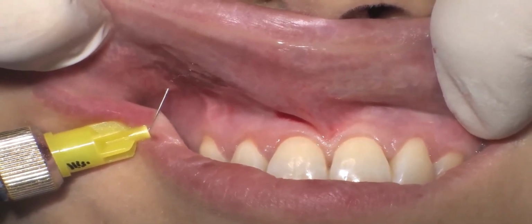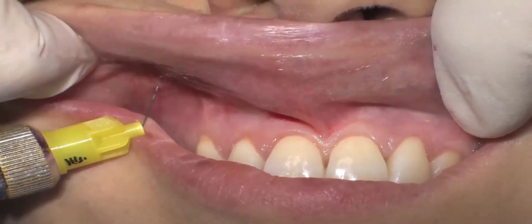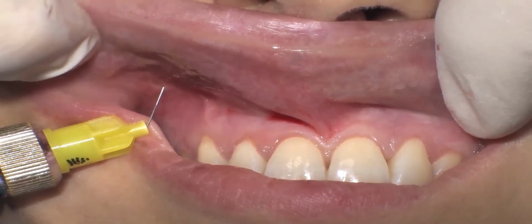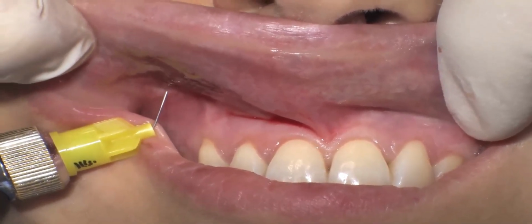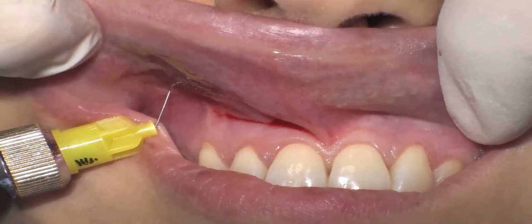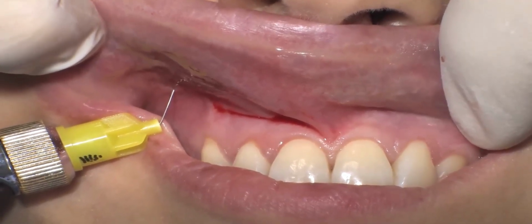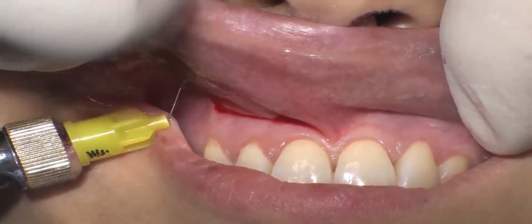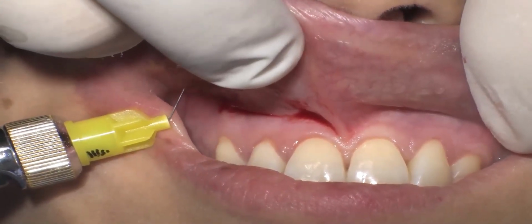I never make anesthesia at the level of the papilla, because the papillae are the vascular bed onto which I give stability to my coronally advanced flap, and I never make anesthesia in the area of the pedicle.